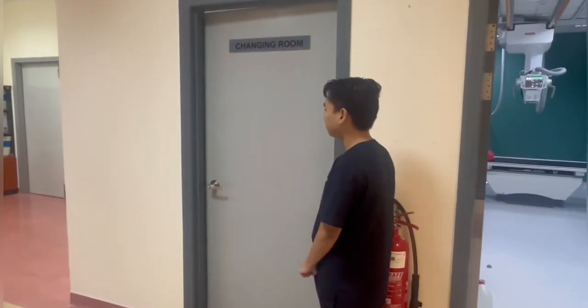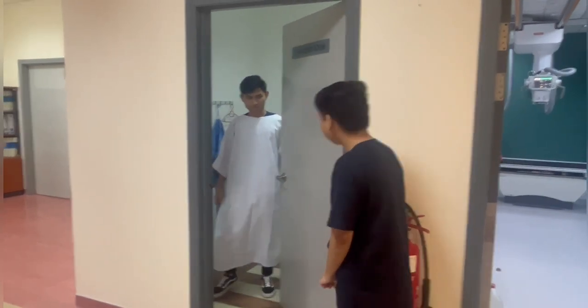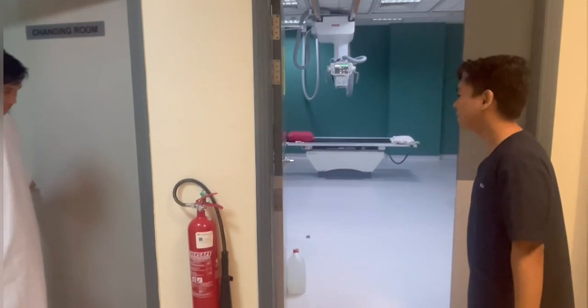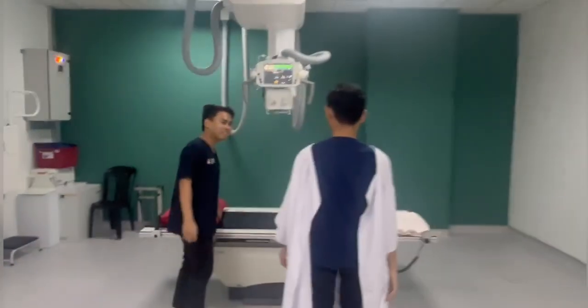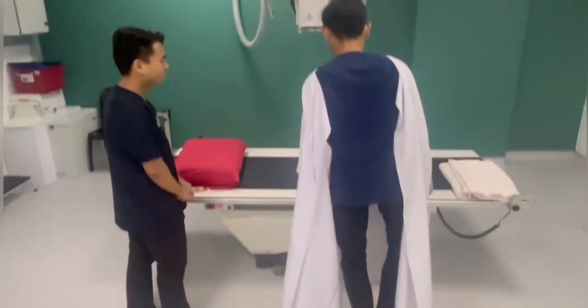Knock on the door to call the patient out. Ensure that the patient wears a hospital gown before performing the examination. Then, when the patient is out, lead the patient to the room. Here, you can explain to the patient about the positioning. So now go to the positioning first.